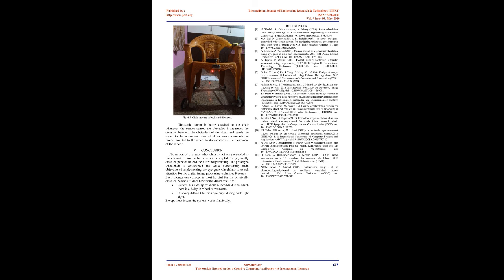Even though our concept is most helpful for the physically disabled persons, it does have some drawbacks, like system has a delay of about 4 seconds, due to which there is a delay in wheel movements. It is very difficult to track eye pupil during dark light sight. Except these issues, the system works flawlessly.